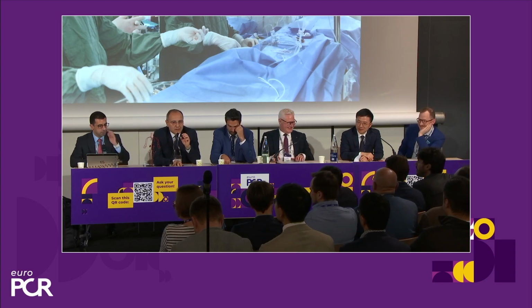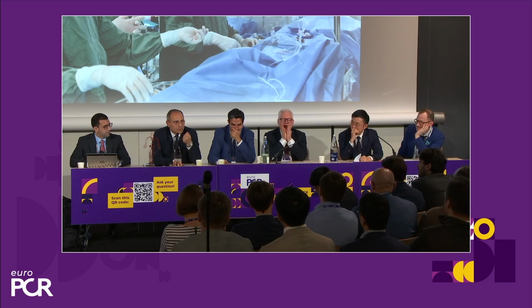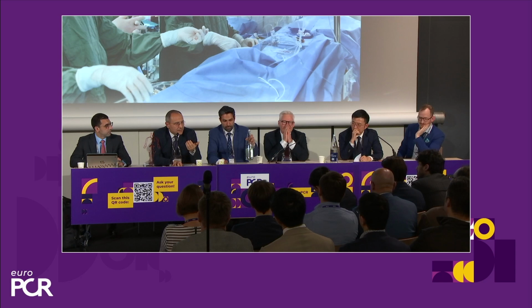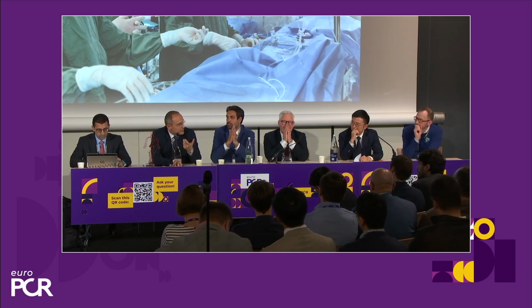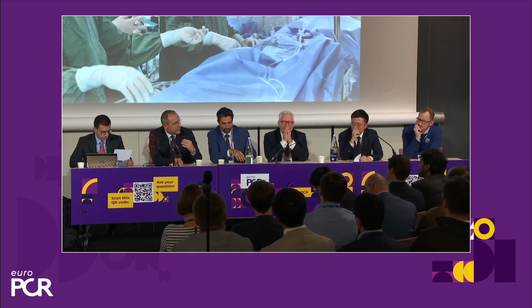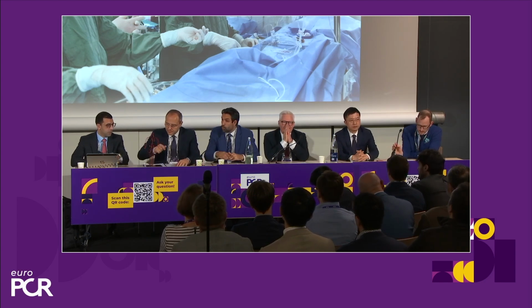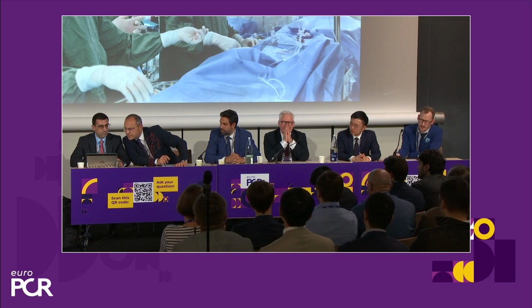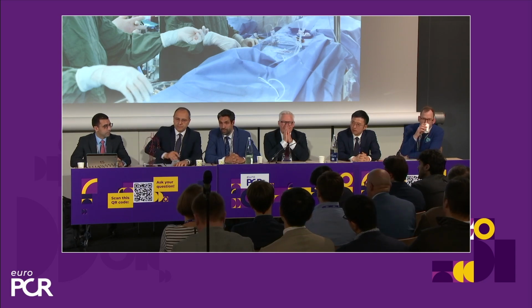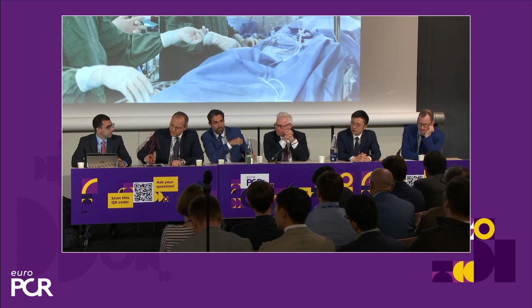I think the question now, what is important for us to understand, is what is the additive value of a pressure microcatheter in a landscape of different tools, different techniques? What is the add-on that this device has, the specificity that other technologies do not have? Anyone want to take this question in the panel? Carlos, perhaps? So, I think that the ease of use of the device itself is one of the main characteristics. And again, I have to highlight, Manuele, that you have seen Jacek and Yin decided to do both, resting and hyperemic.